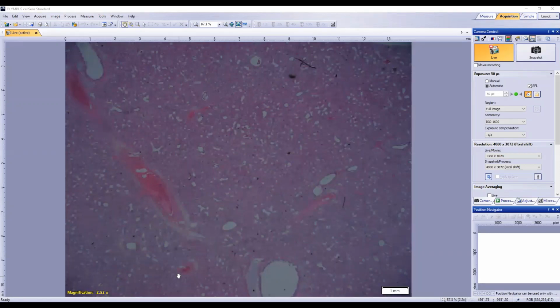If I go for a test, just a subgross, this is also still subgross. Yeah, absolutely. The lung parenchyma diffusely appears highly cellular and consolidated. Yep. So that's our overall impression.